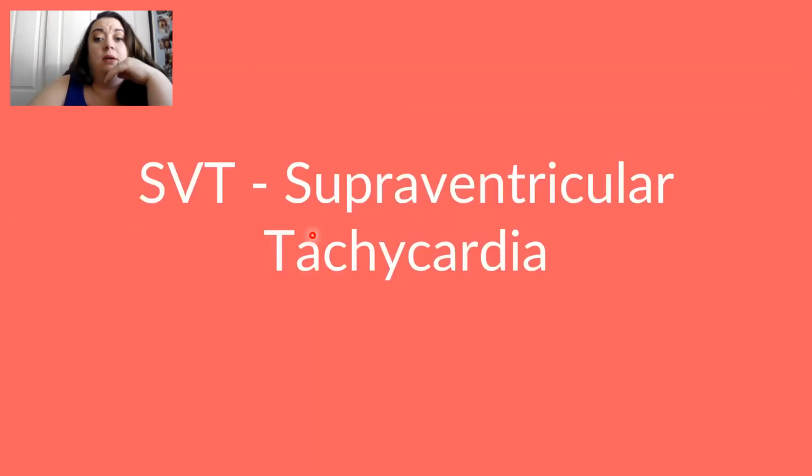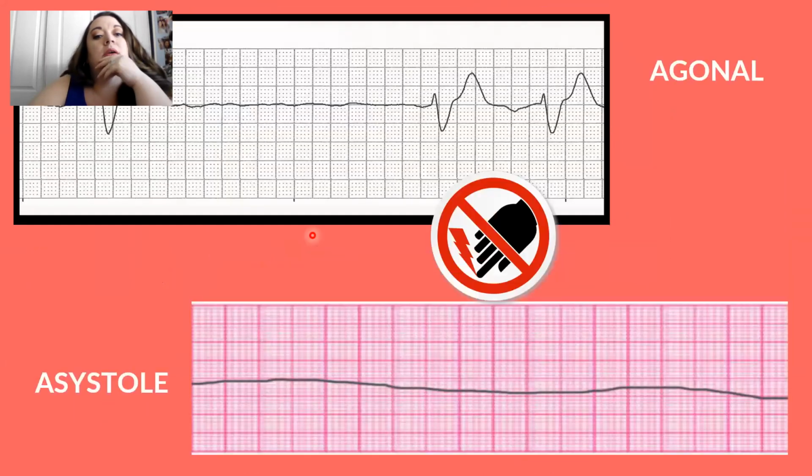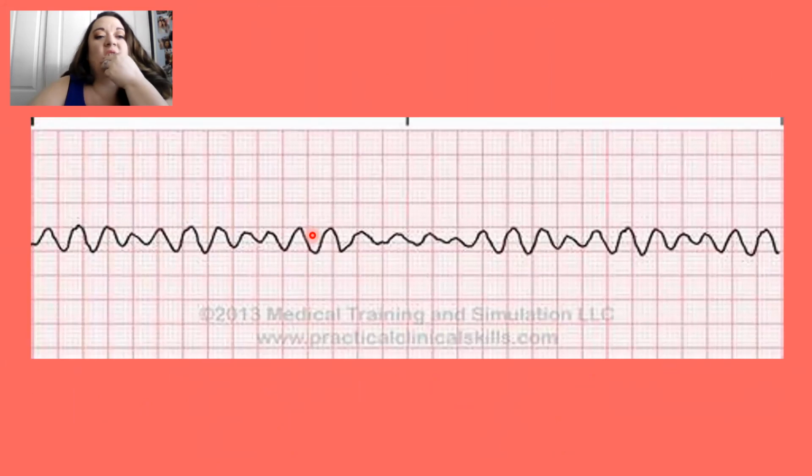We're just gonna basically pause, check the rhythm, check for a pulse. There's no pulse. That is not a shockable rhythm. We're going to jump right back into our CPR. Any questions on that one?